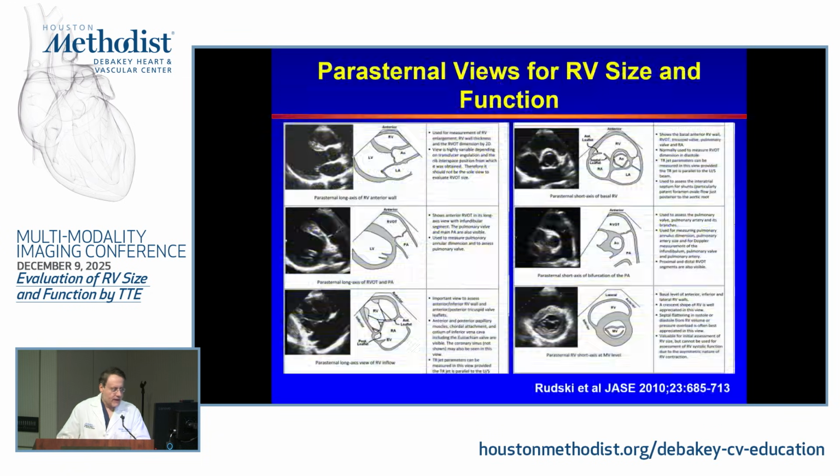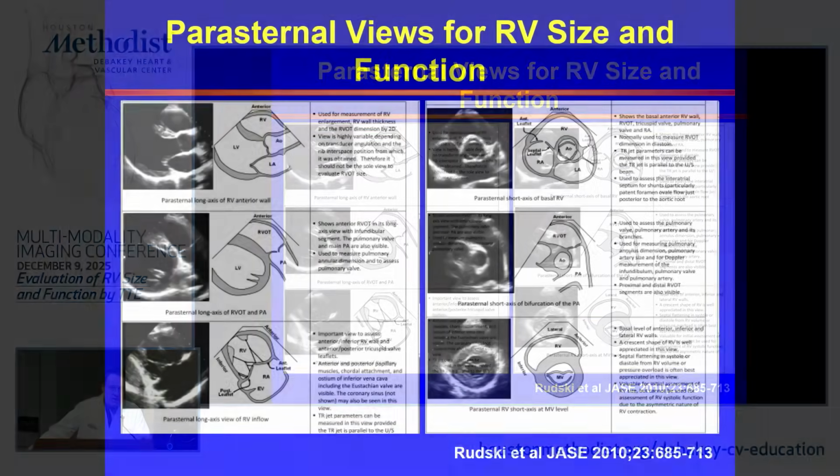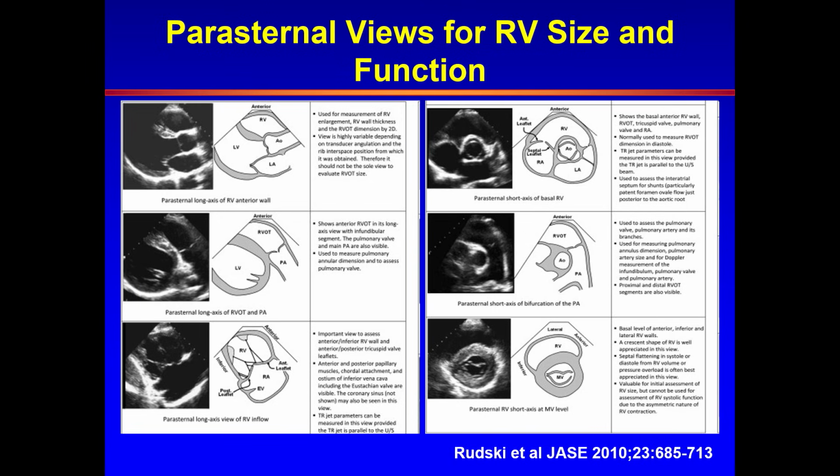Okay. For echocardiography, it's a tomographic technique. We also do 3D. We'll talk some about that. But these are the standard views that we get the RV from, and we want to acquire them and put things together. The right ventricle is a complex structure, and you do not get to see the whole ventricle in just one view. So that's why we need to patch different views together.